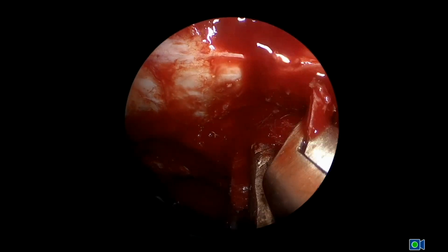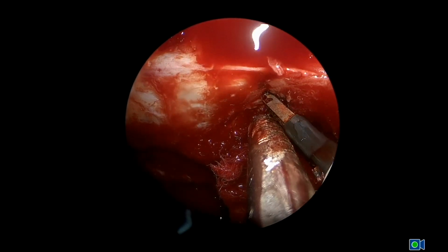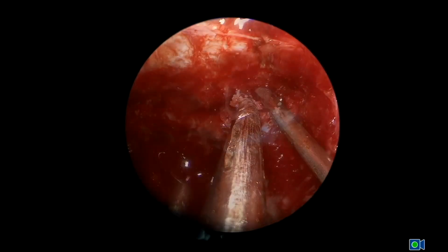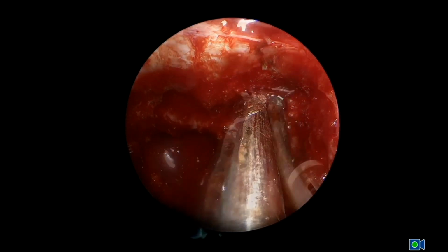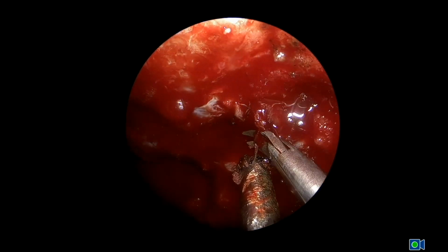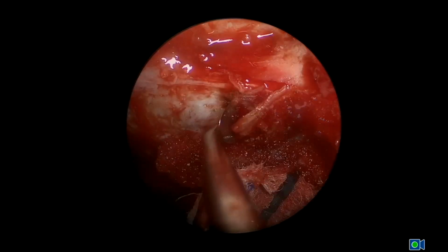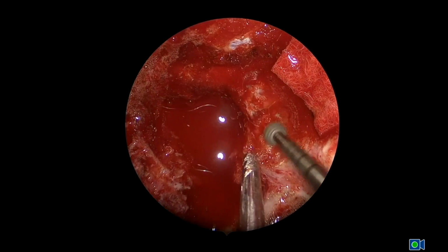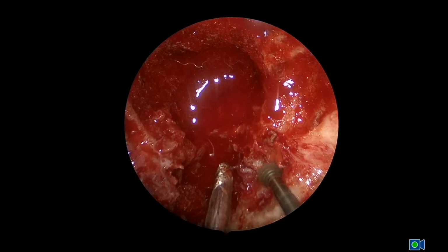And this is removing the bone that covers the clinoidal segment of the carotid artery. We obtain bleeding again from around that area. Feeders directly going to the tumor. That's the opening, the cavernous sinus being partially open. It's important in this case to remove all abnormal bone, and that's why we are being aggressive, removing this area here stuck to the carotid artery in the clinoidal space.